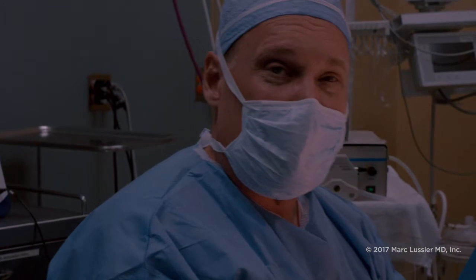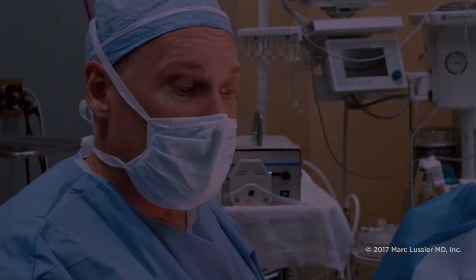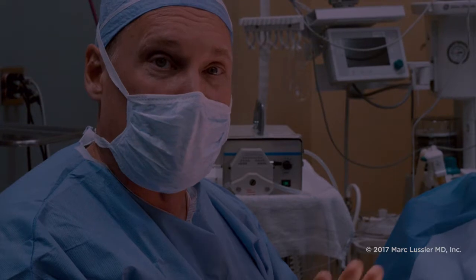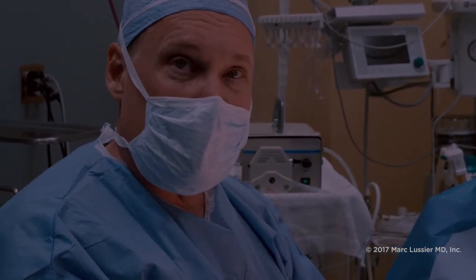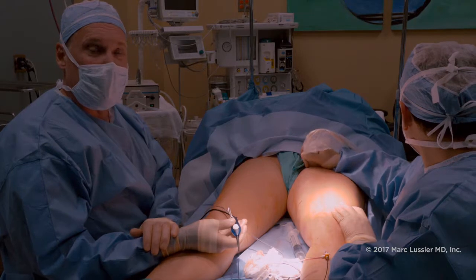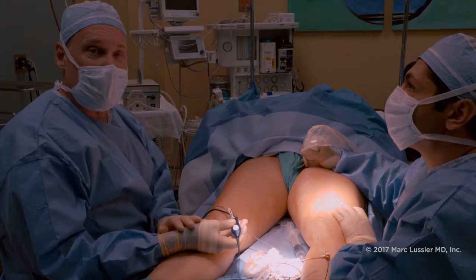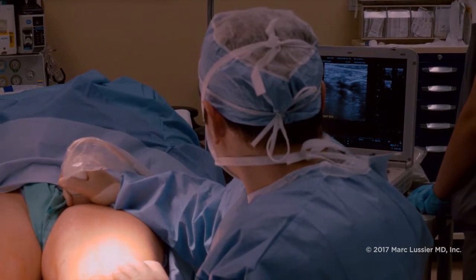We've just completed our first treatment, and often we'll treat twice in this area. The equipment behind us is very carefully controlled — it measures the amount of heat we're dispersing into the tissues, strictly controlled by time. It's very comfortable for the patient; she feels nothing at this point. It's also very safe because Surin is using the ultrasound to confirm that the catheter is in the right place within the vein.